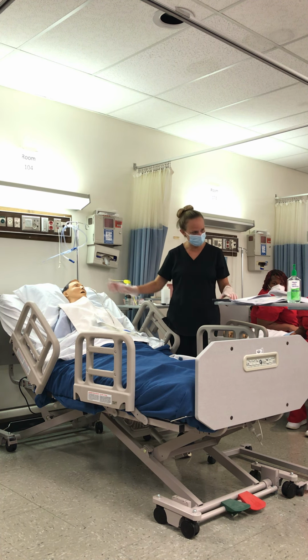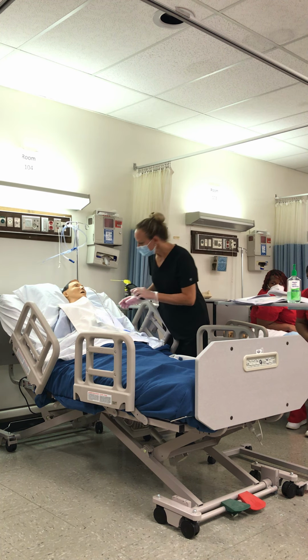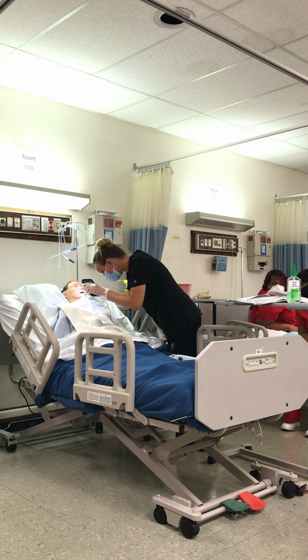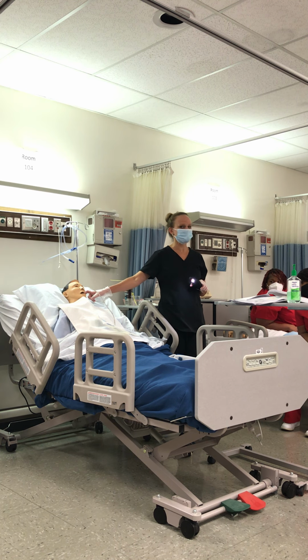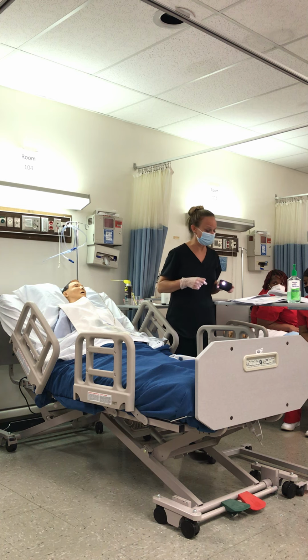So we've stopped at that first mark. Where should we be in the body right now? Right. Back of the throat. So I want to look back here. I don't see it yet. So we're going to be looking into the back of the throat. What are we going to be looking for? See if it's coiled. Coiling. Making sure it's not shooting right out the mouth. I've seen that happen before. I haven't done this, I've seen it being done a lot, but anyway.